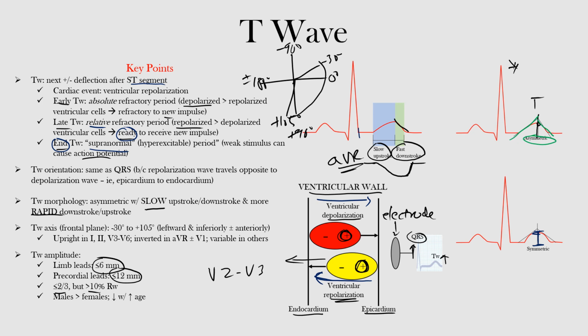Well, that's the end of this lecture. We discussed the T wave, specifically what it represents, and how it should normally appear on the EKG. I hope you learned something.